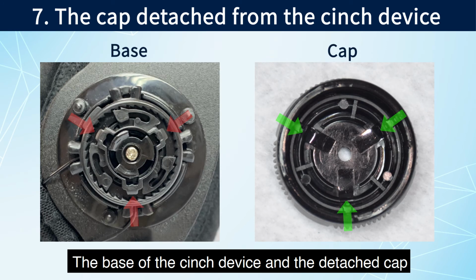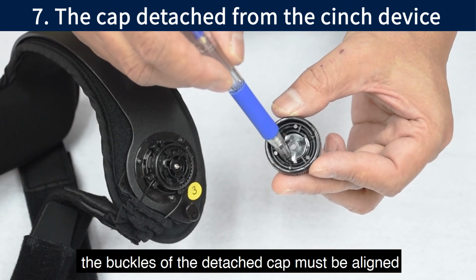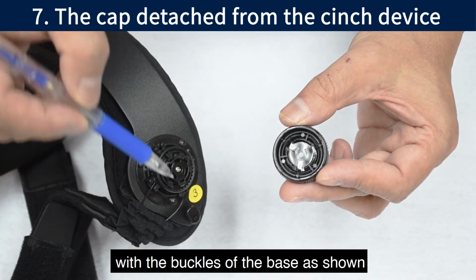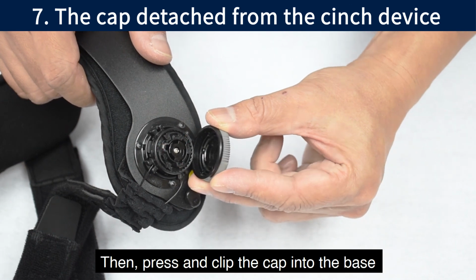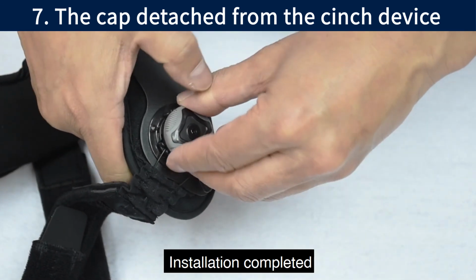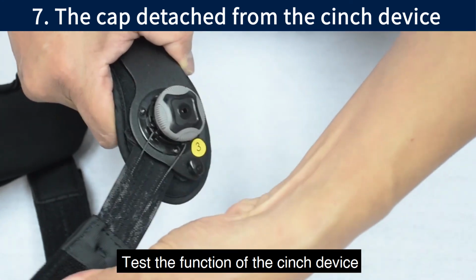The base of the cinch device and the detached cap have 3 buckles which are arrowed respectively. For installing, the buckles of the detached cap must be aligned with the buckles of the base as shown. Then, press and clip the cap into the base. Installation completed. Test the function of the cinch device.